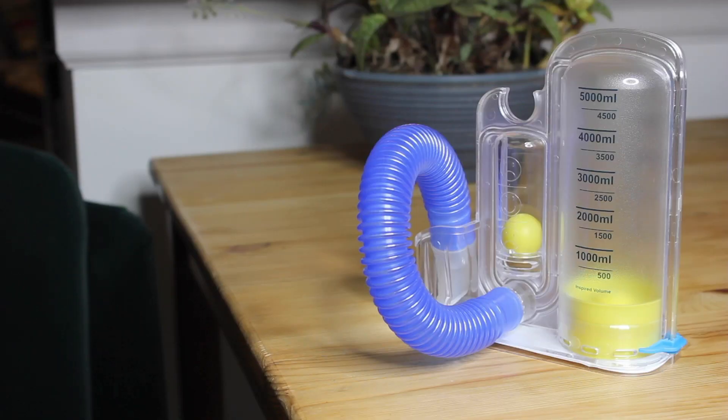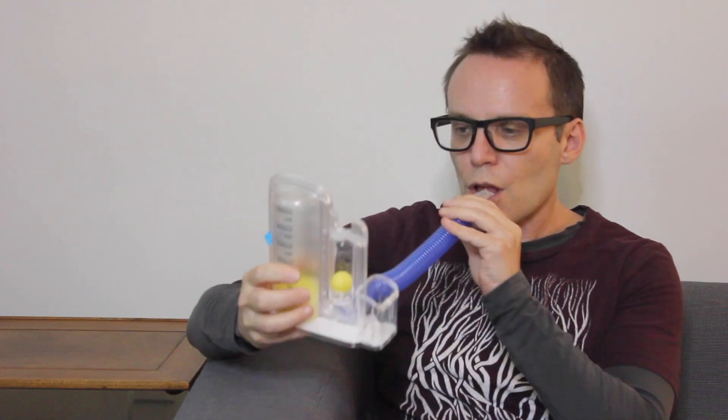Repeat these sessions four times a day, or as prescribed by your doctor or provider, to exercise and expand your lungs, inhaling ten times each session. We recommend working Spirometer usage into your daily routine — for example, using the Spirometer during TV commercial breaks. With regular use, you'll be on your way to lung health and recovery.